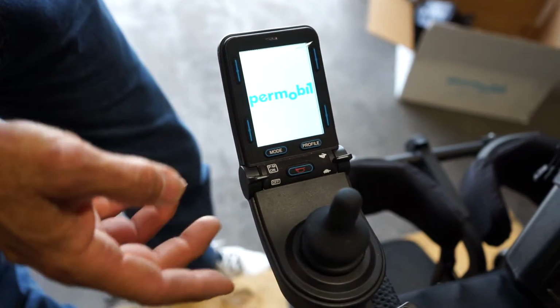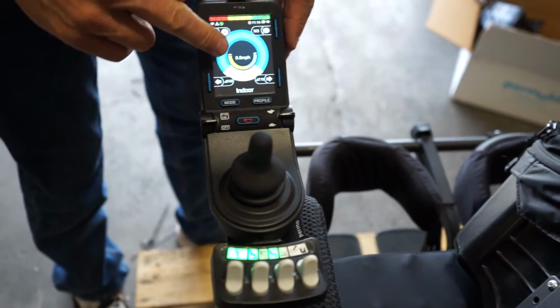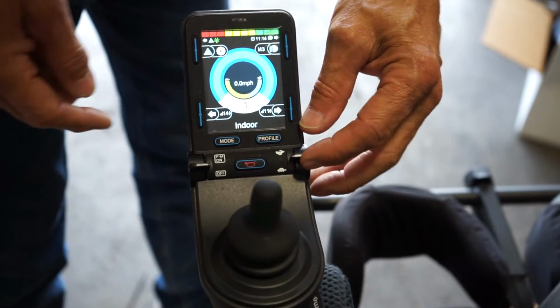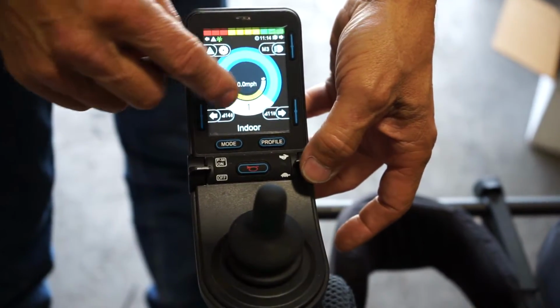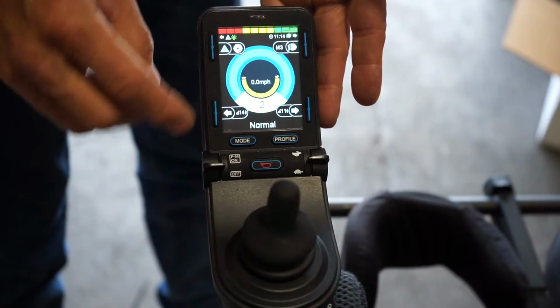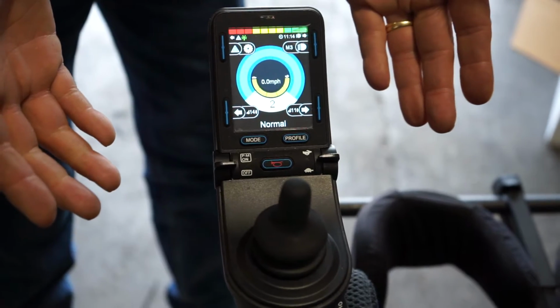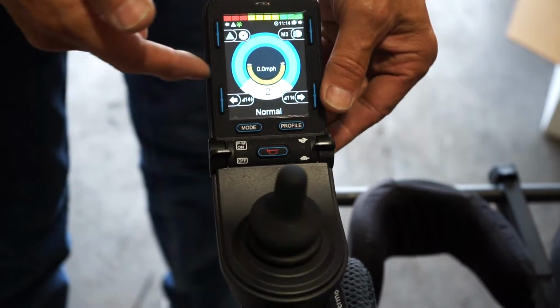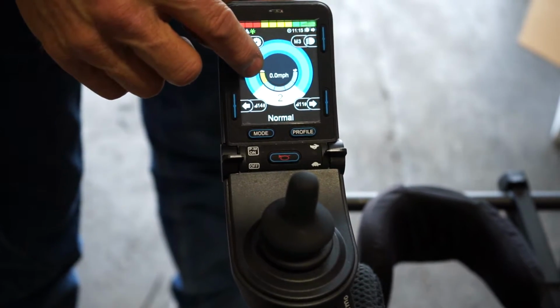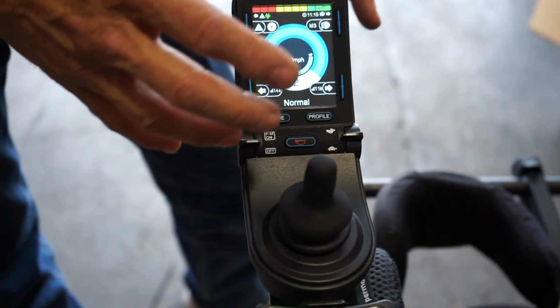We are here on speed number 1, three yellow lights, so it's not full speed number one. If I want to go all the way to speed number one full speed, I can push the button forward. You see the yellow light comes on, and now we're at speed one full speed. This would be outside speed, full speed, up to 6.5 miles an hour. If you want to reduce it, you can go down this way and be at the second speed, first yellow light. That's so you'll be at a slow second speed.